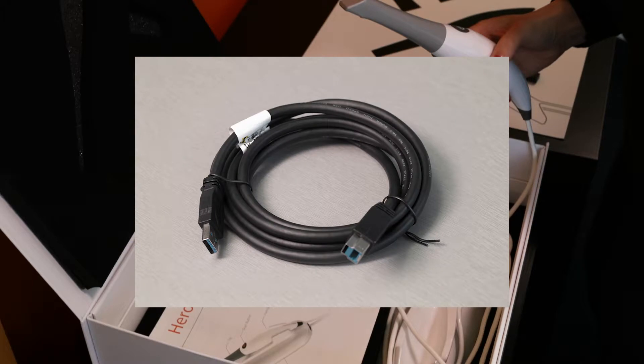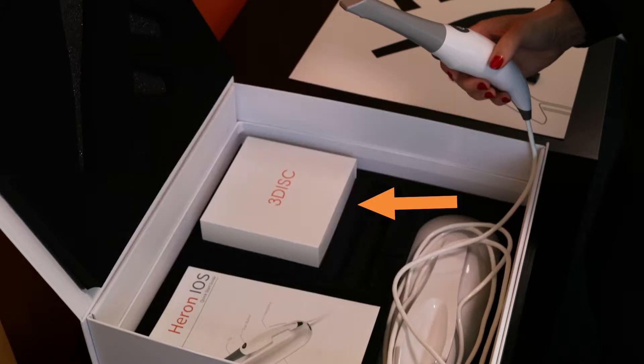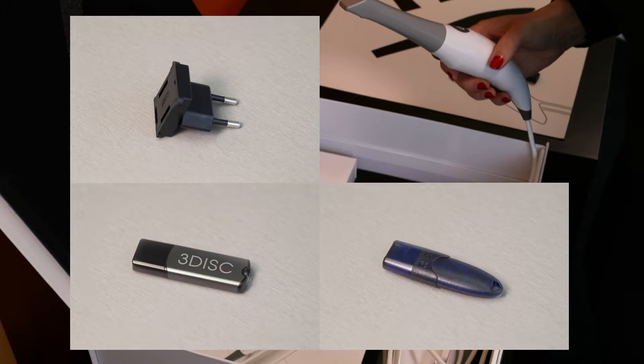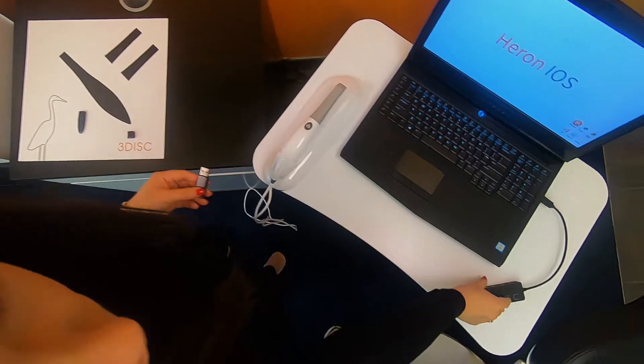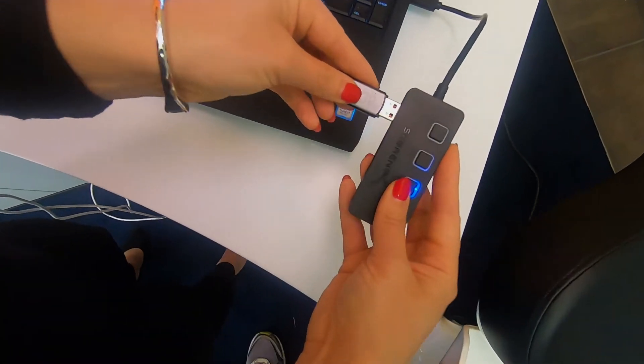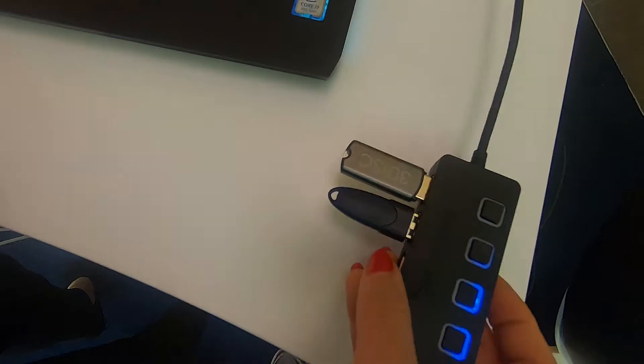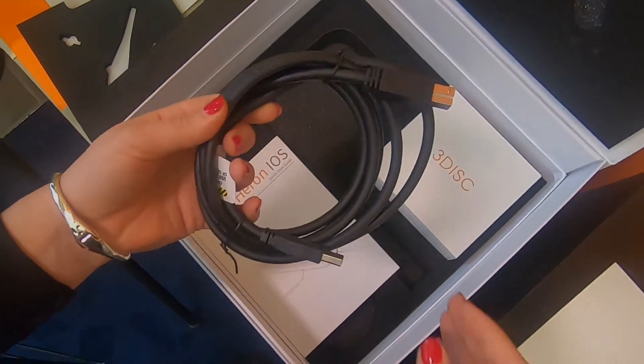Also included in the box are a USB 3.0 cable, a box with four electrical outlet converters, two software dongles, and an AC adapter.